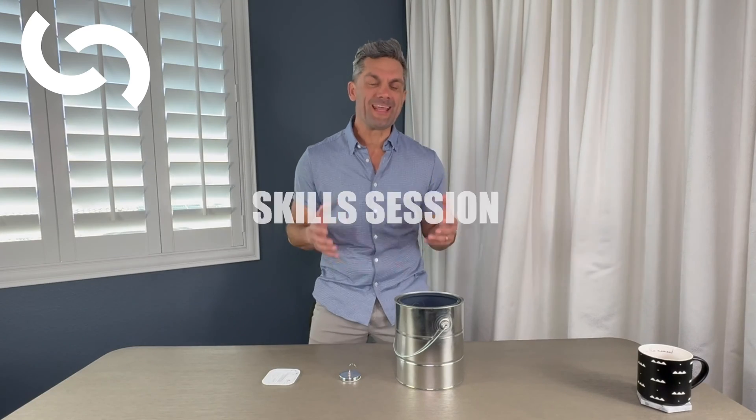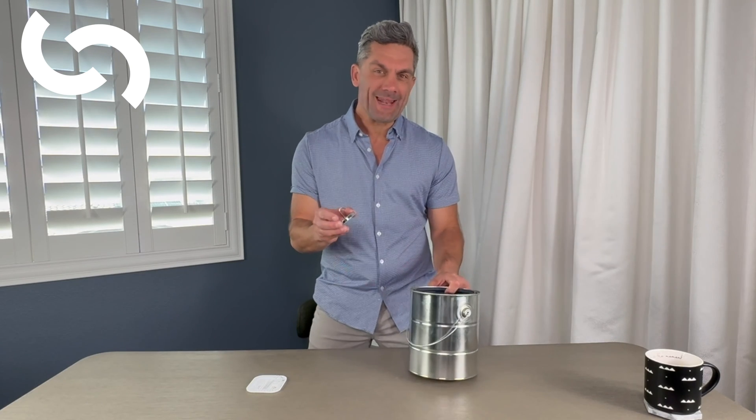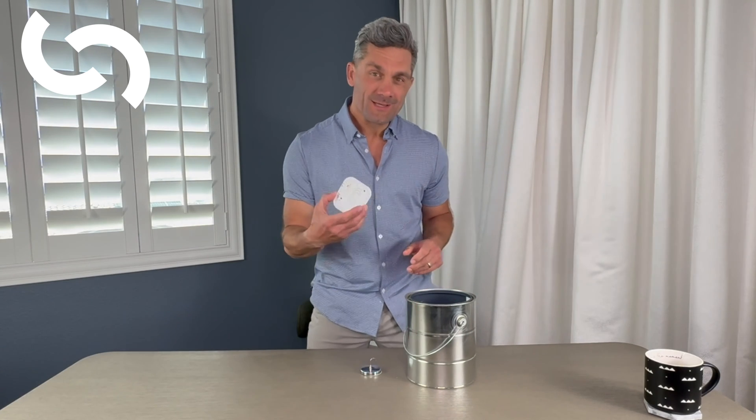We're going to do a skills session today at Citizen Surgeon. I'm going to show you how you can practice tying at home with the help of an empty paint can, a magnetic hook, and of course some suture.